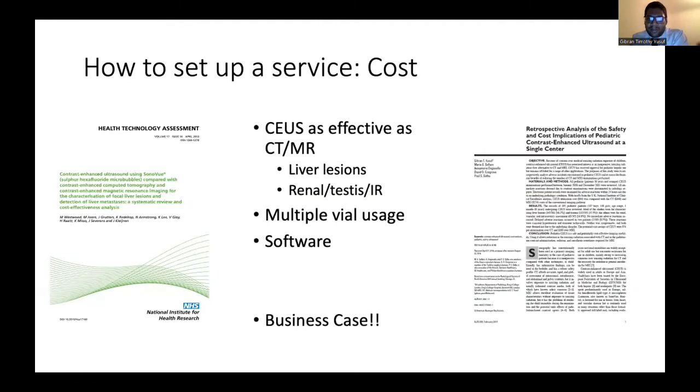The first thing to pay attention to is that they looked at incidentally discovered focal liver lesions, screening in colorectal mets, and screening for surveillance of chronic liver disease, and whether or not it was cost effective. But most importantly, in each case, contrast enhanced ultrasound was as effective as CT or MRI. Whilst the cost may be different, it was ultimately as clinically effective.